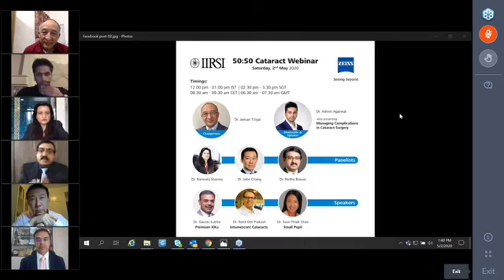Once that is done, then usually these uveitic pupils open up to 5.5 even, and then with adequate viscoelastic, it stretches out a little more. And these pupils usually will not shrink at all during the course of the surgery, which is different from the atonic pupils or the ones with the IFIS.